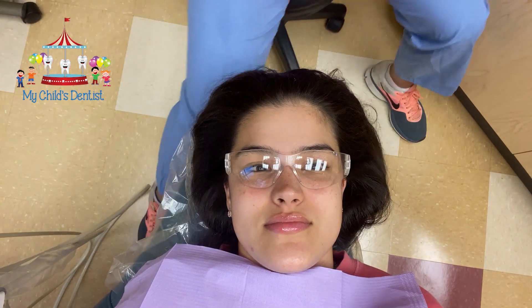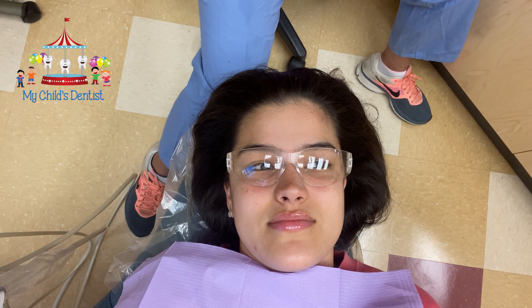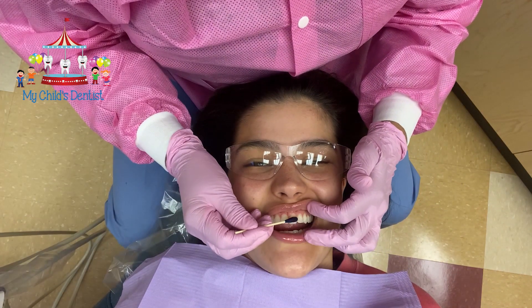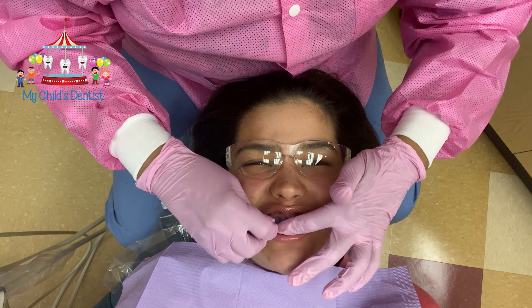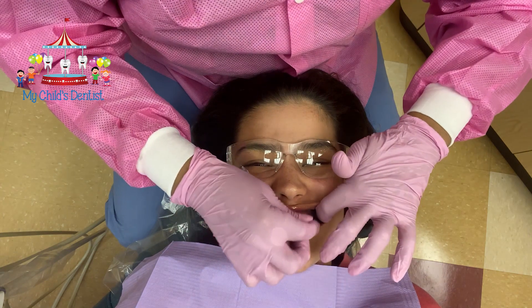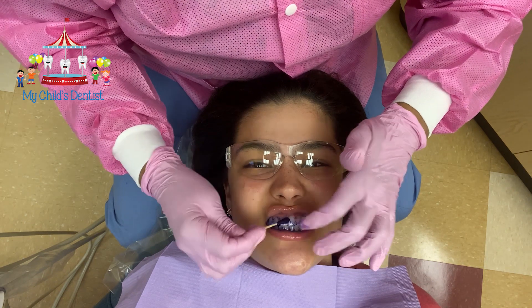This is called disclosing solution. This solution is purple and has a pink tint to it, and the purpose of it is to show us where Gabriella's plaque is accumulating. When we put this stain on, you'll see it's going to mix in with her saliva a little bit. We're going to spread it around — what we're looking for are areas where she'll have pink or purple.